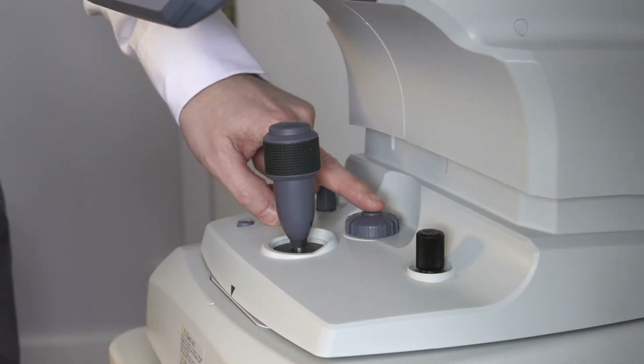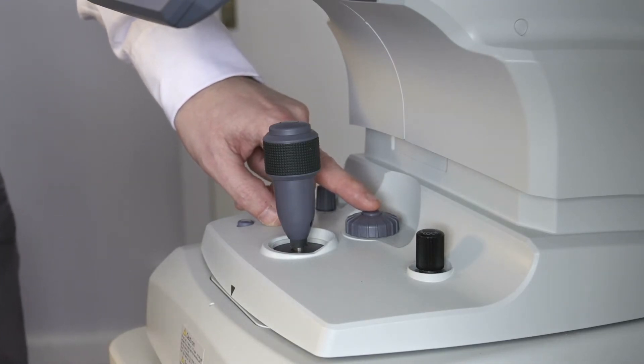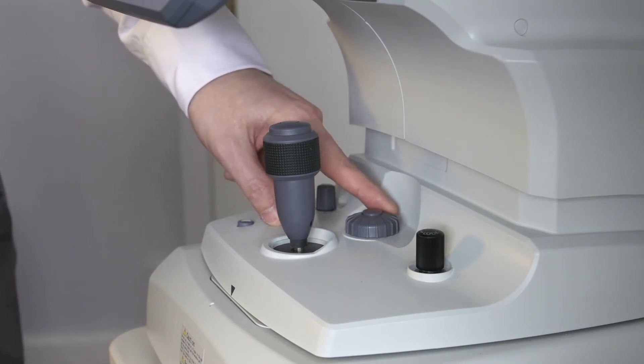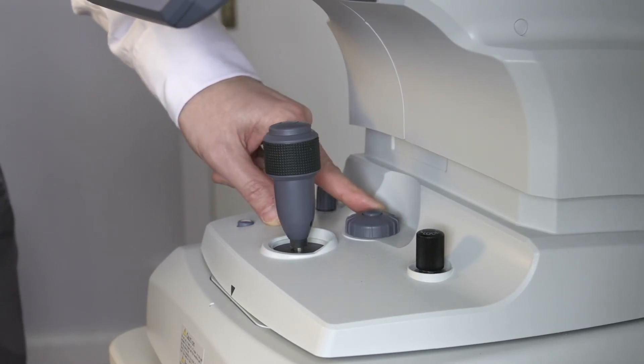At the back here, the button is used in manual mode when we are moving from anterior eye into the fundus. The wheel is used for manual adjustment of focus.